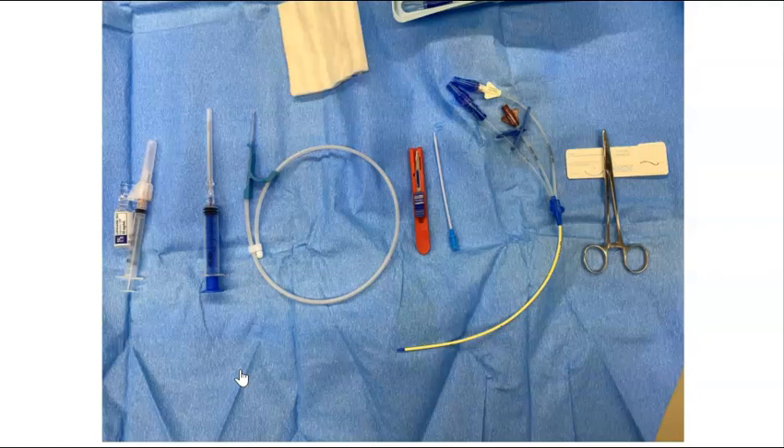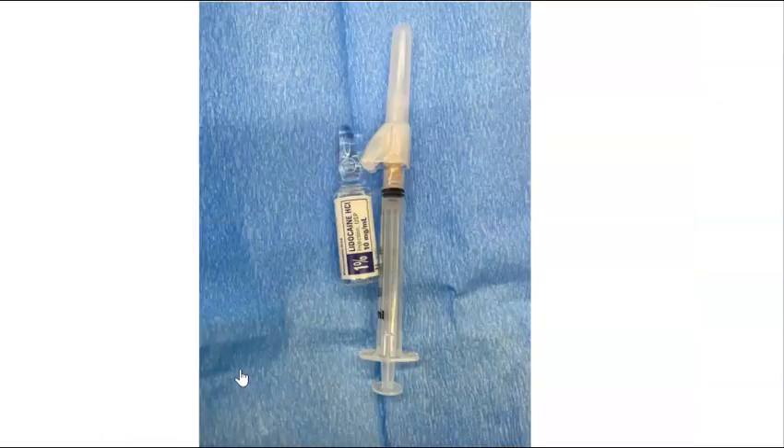This is also the time to flush your CVC, flushing all three ports and leaving the brown port open — that's the brown port indicated by the arrow. Now you're ready to get started with the procedure. Step one is to inject lidocaine into the area of skin you will be performing the procedure. This should be done under ultrasound guidance for safety and so that you know that you are providing adequate analgesia in the correct location.